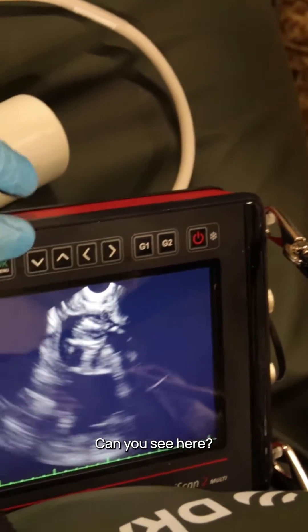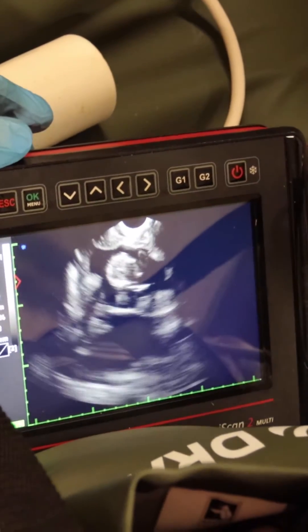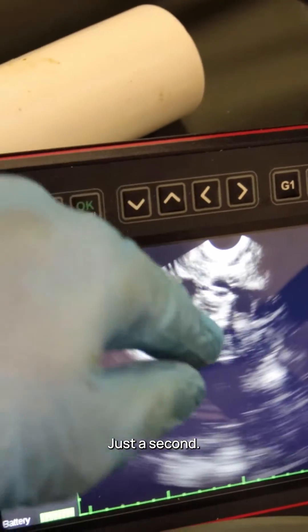Can you see here? This moving structure is the heart — so we can see the heart beating.